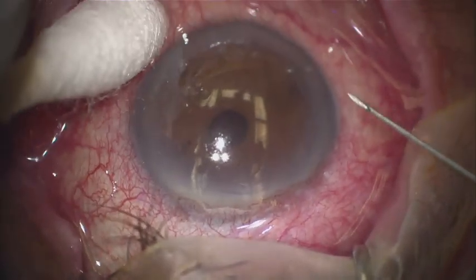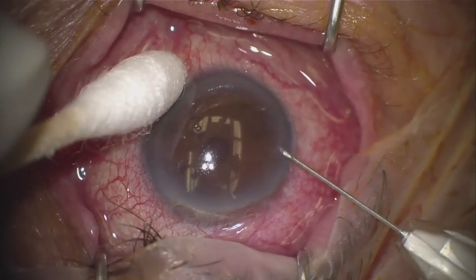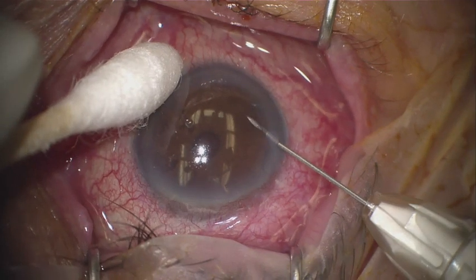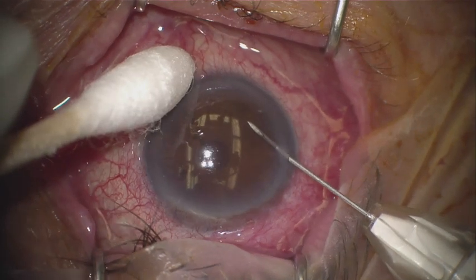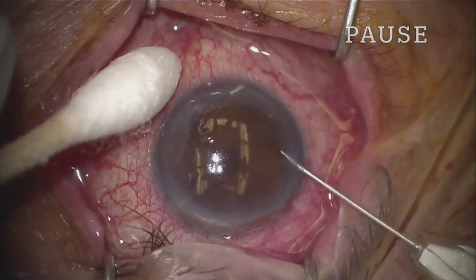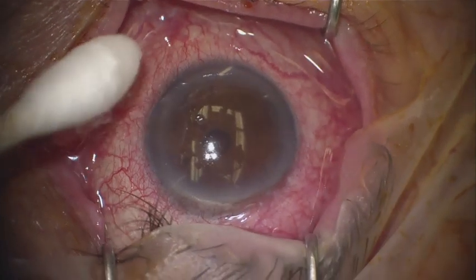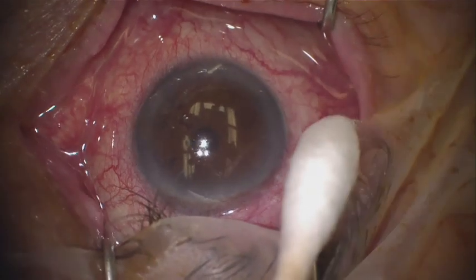Using a cotton tip applicator for stabilization, I take the injector. I aim the tip temporally at the limbus. Through clear cornea, the injector tip enters the anterior chamber aimed inferiorly. I depress the button on the injector firmly, releasing the Durista implant. I pause and slowly withdraw the injector tip. This is followed quickly with tamponade of the incision site with the cotton tip. And the procedure is done.